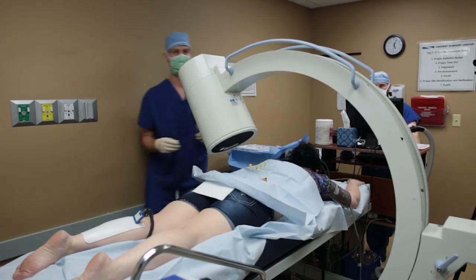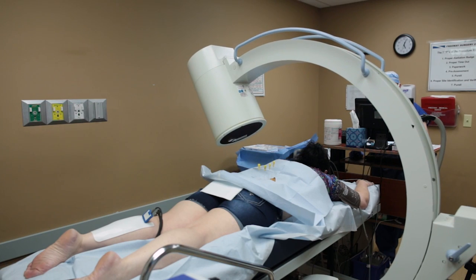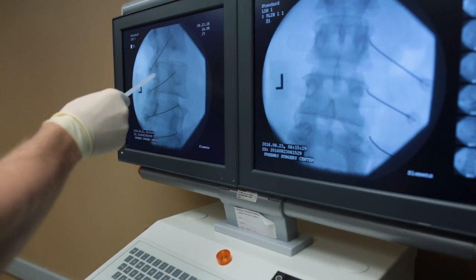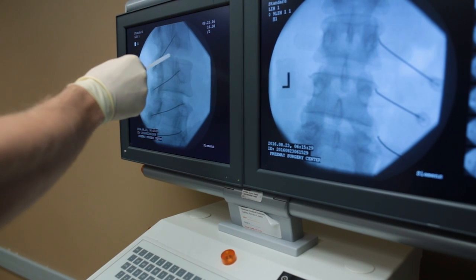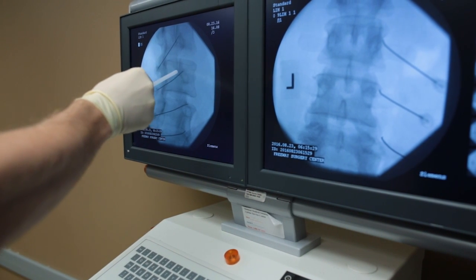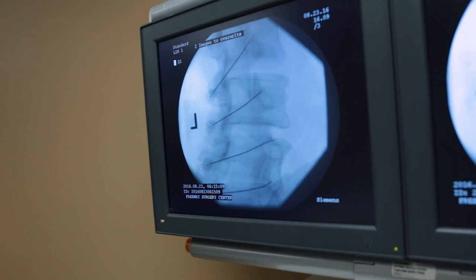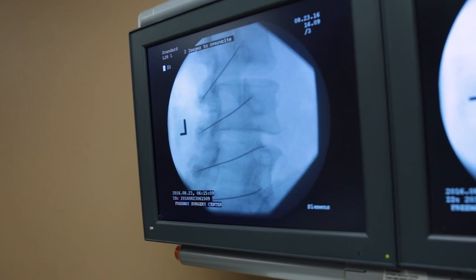We're going to use x-ray and multiple x-ray shots to make sure the needles are in the perfect place. We can confirm that the needle is placed on the bone right near the joint where the nerve runs that innervates that joint. We're in good position in all four levels.